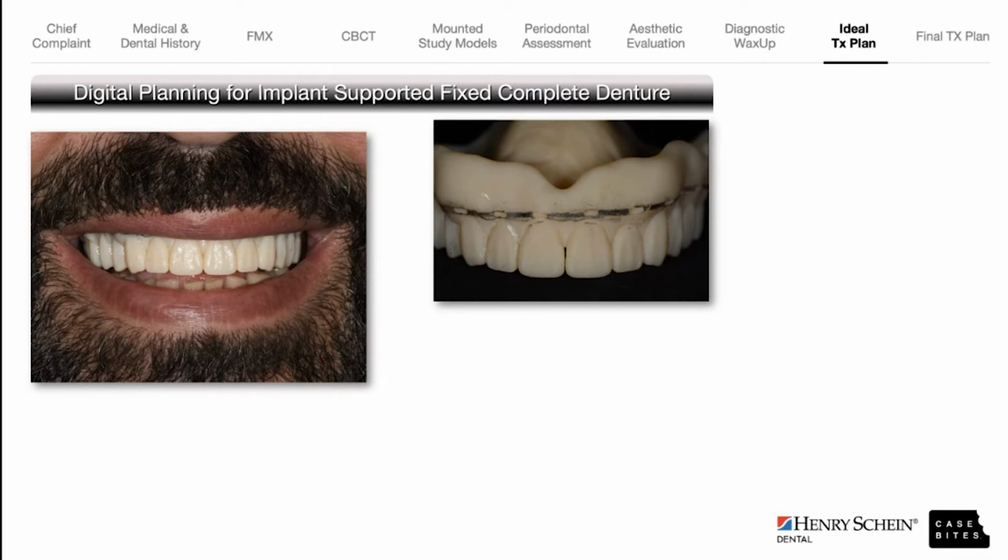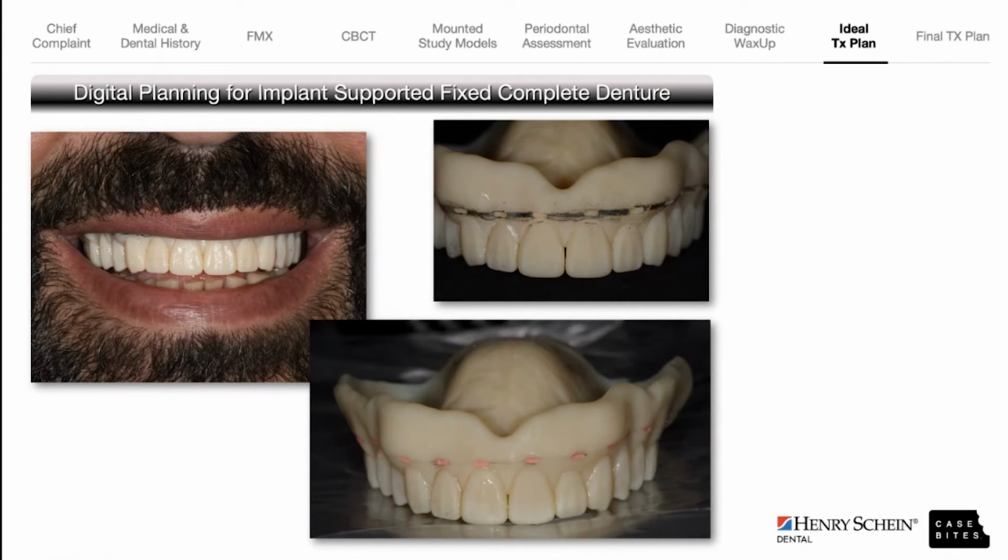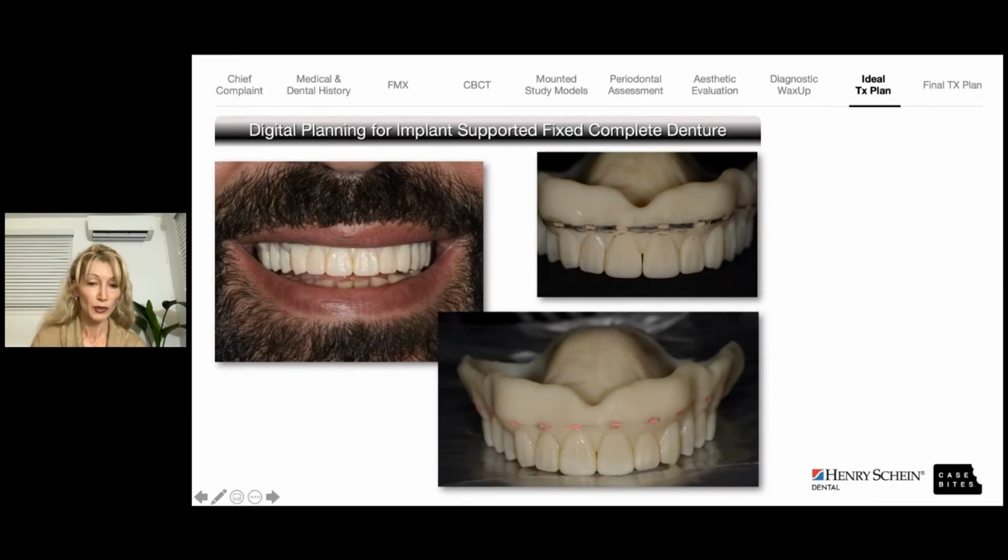We want to see worst case scenario, what the patient would be showing. So in my protocol, I like to mark that line and put some sort of a radio opaque marker on that line before we do the CT scan. So in this case, we marked above every tooth and put a gutta-percha marker.